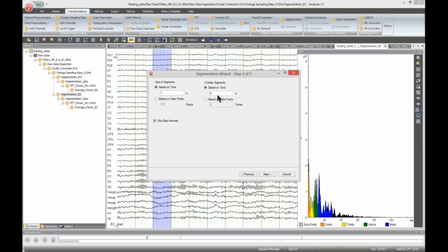So if you think that the specific task that you would like to analyze is stable within 1 second, then that second can be considered, or is feasible to say this duration is quasi-stationary. Or if you think within 2 seconds I still have a very stable signal, then that 2 seconds, for your task or for a paradigm, can be considered as quasi-stationary.